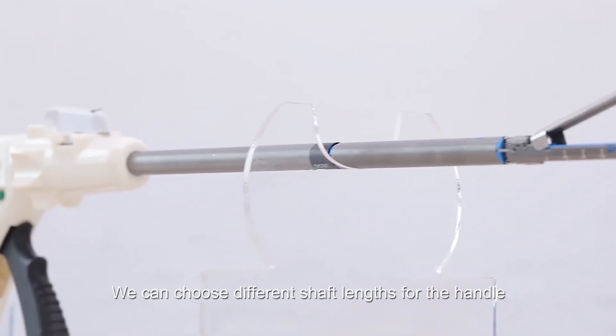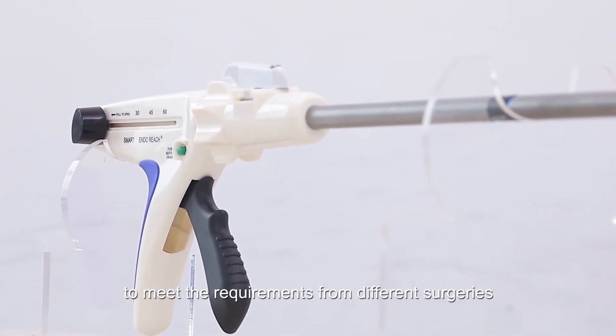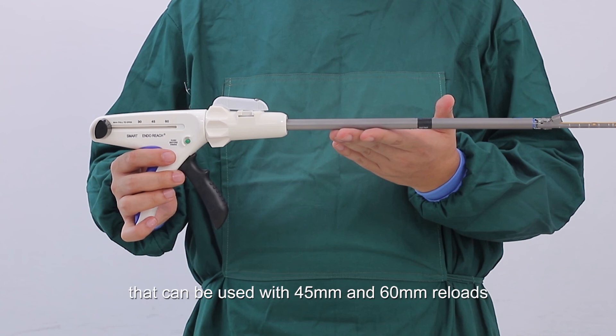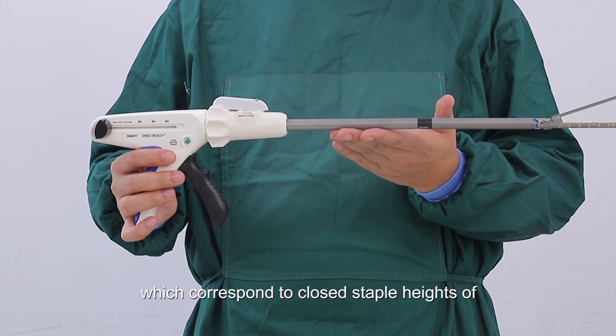To emphasize again, we can choose different shaft lengths for the handle to meet the requirements of different surgeries. There are also different reload sizes and colors to meet different demands. A single stapler handle can be used for 25 firings. The stapler is a universal handle compatible with 45mm and 60mm reloads. The four different colors — white, blue, gold, and green — correspond to closed staple heights of 1.0mm, 1.5mm, 1.8mm, and 2.0mm.